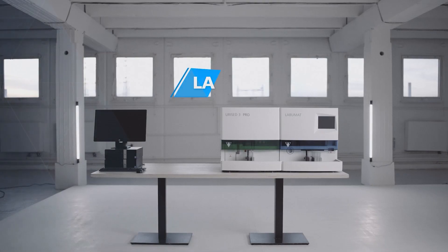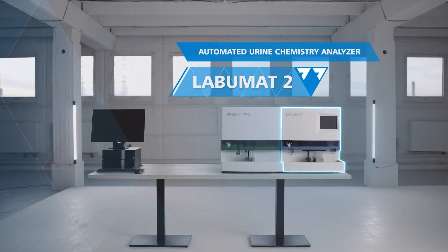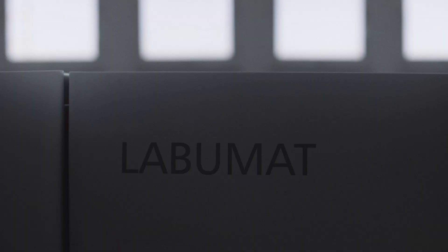Labumat 2 is an automated urine chemistry analyzer that evaluates 10 chemical and 3 physical parameters.